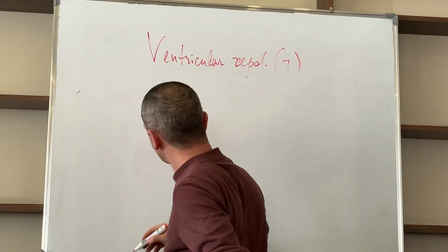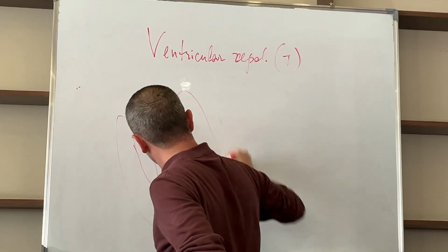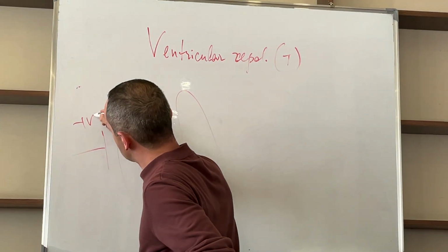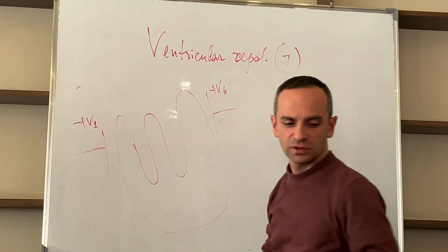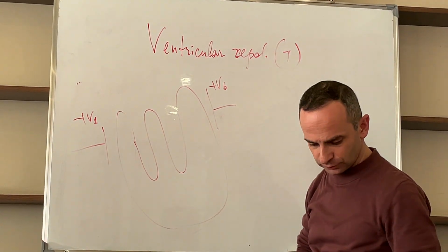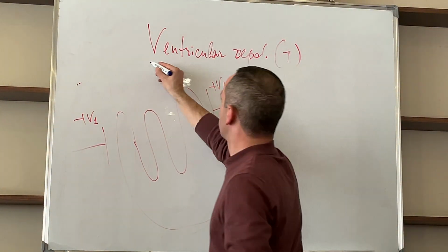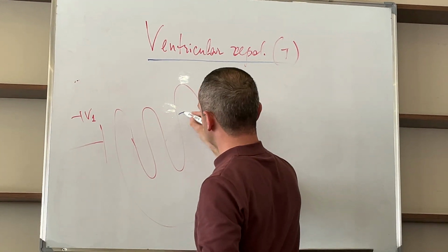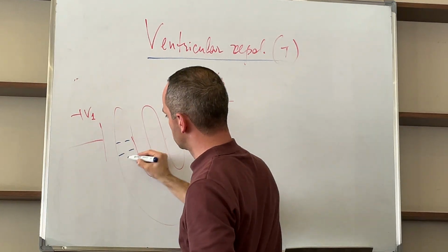Again, plus V1, plus V6. What we have? Everything was negative, yes, starts repolarization.